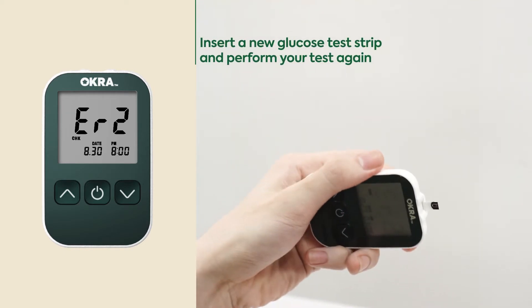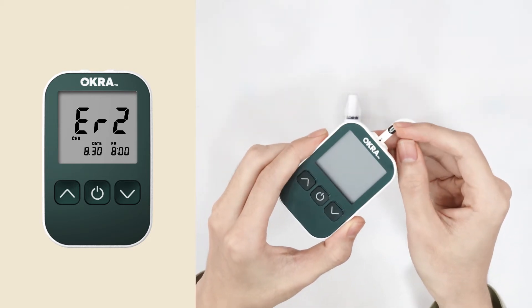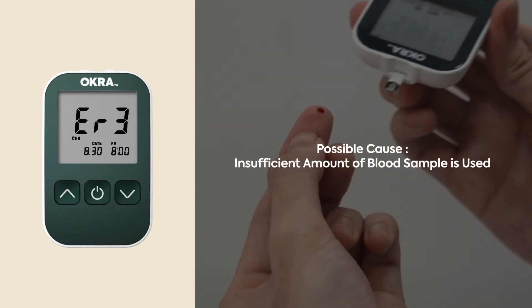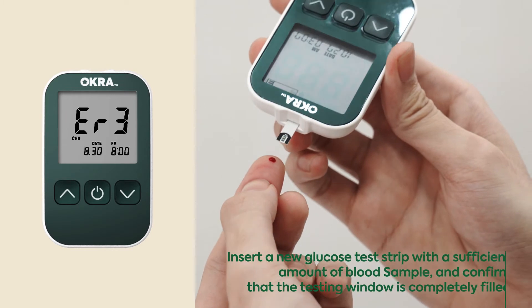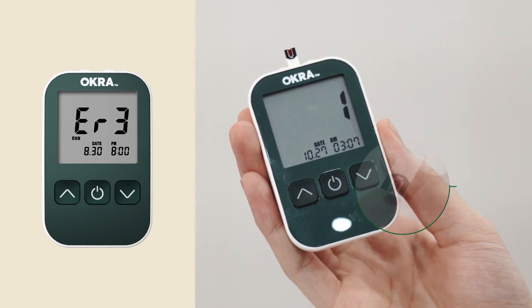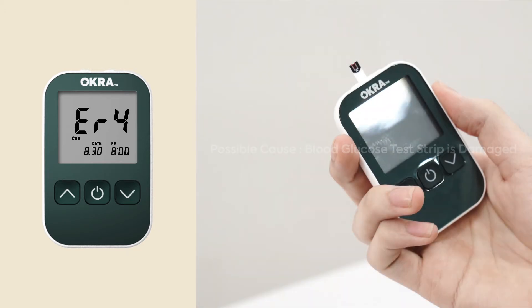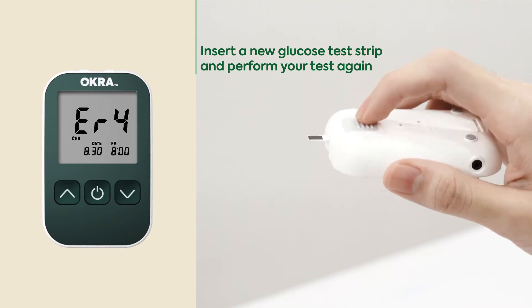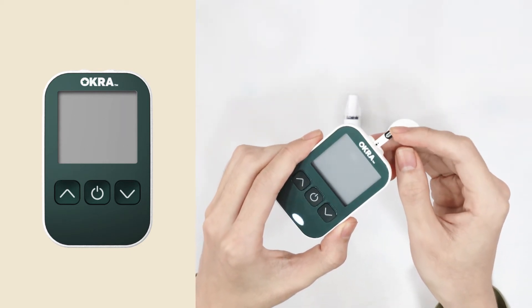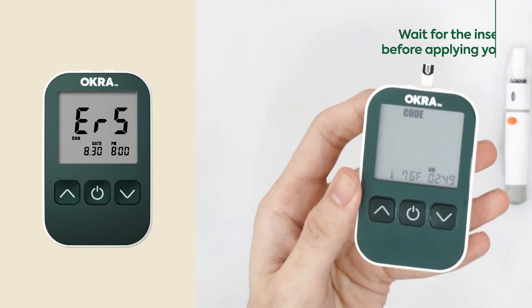Please insert a new glucose test strip and perform your test again. Please insert a new glucose test strip with a sufficient amount of blood sample and confirm that the testing window is completely filled.